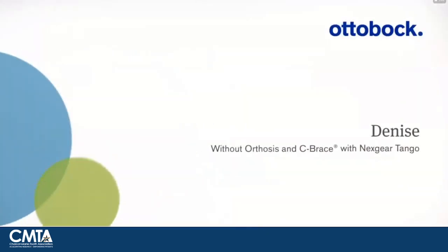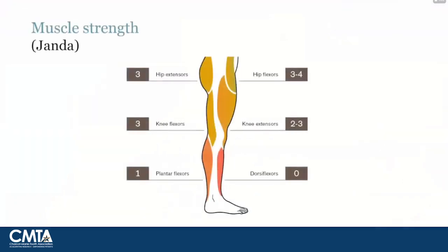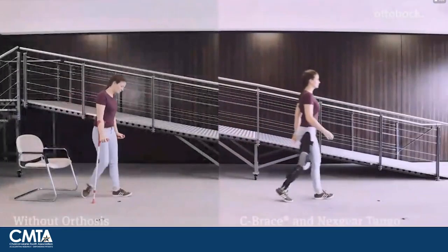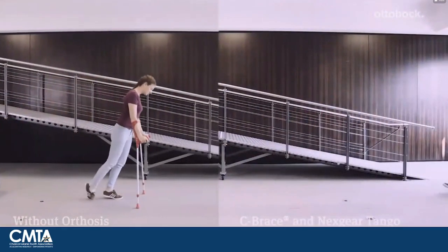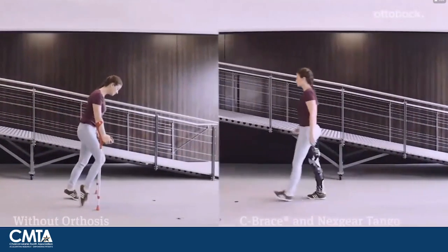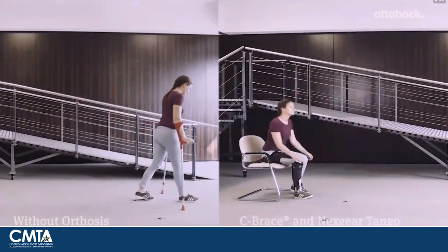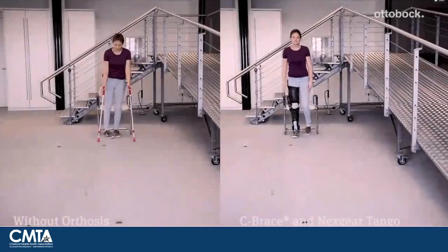We've got another lady here who is wearing a C-brace, and she's also wearing a Next Gear Tango, which is an advanced ankle joint that we've put on the C-brace for her. You can definitely tell, it's very obvious right away how much better she walks with the C-brace and with that Tango joint. Without that orthosis on, when she's using those forearm crutches, she is really concentrating on every single step that she's having to take.